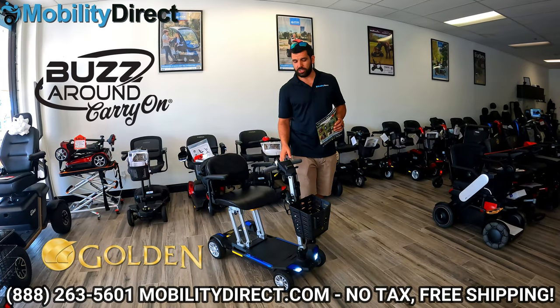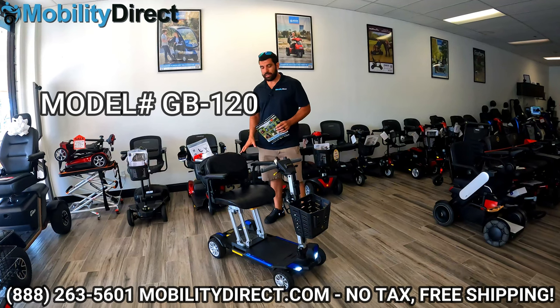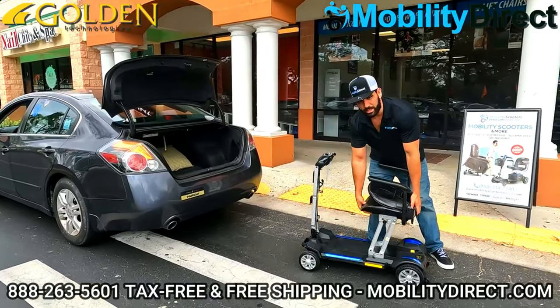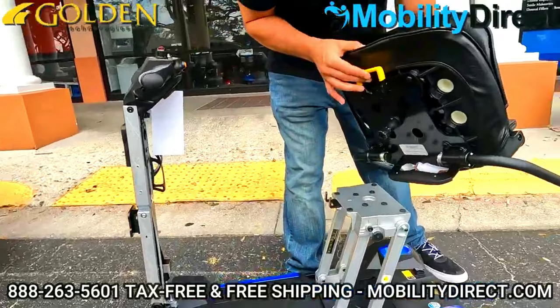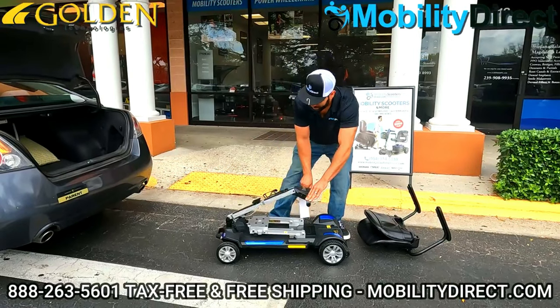This is the Golden Technologies Buzzaround Carry-On. The model number is GB120, and what makes it unique is the fact that you can fold it flat. Unlike any other folding mobility scooter, you can fold it flat. The seat does come off, and the handlebars fold down, and there are some convenient handles on the side.